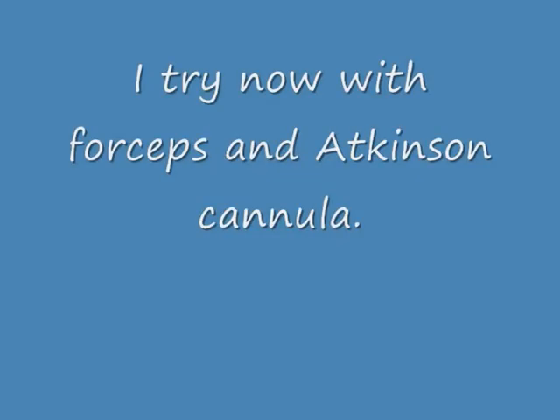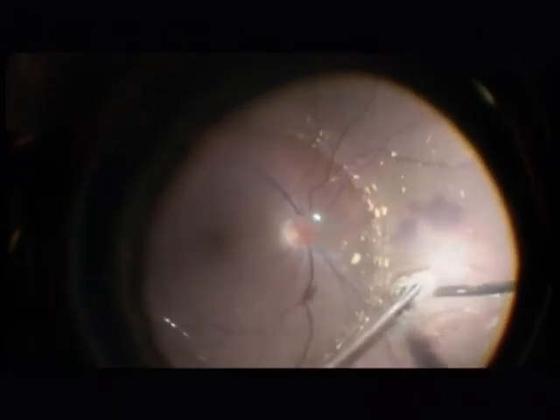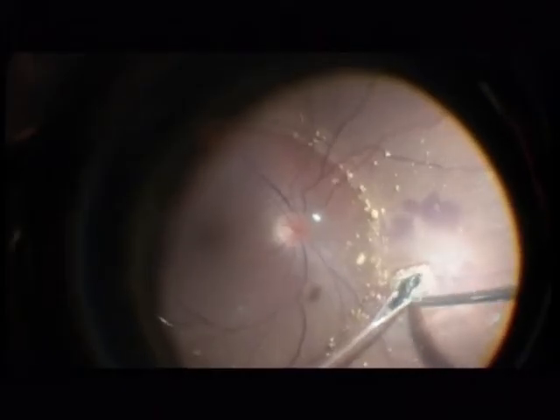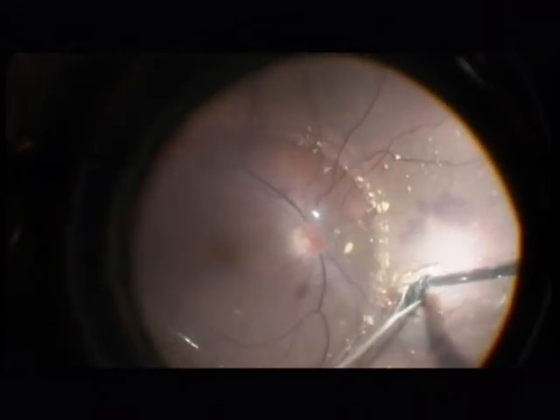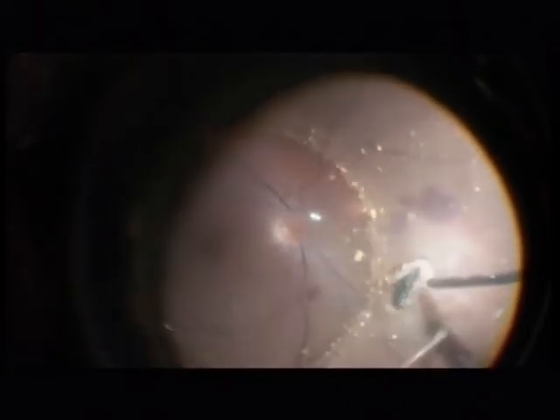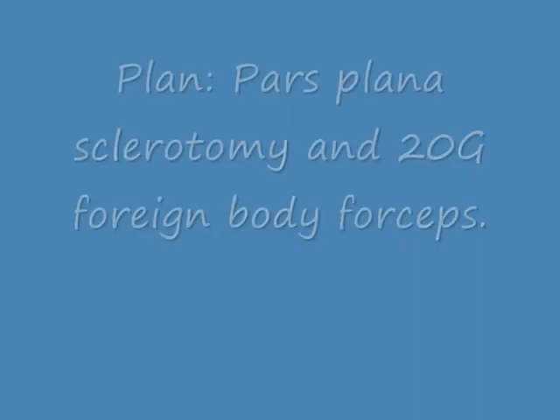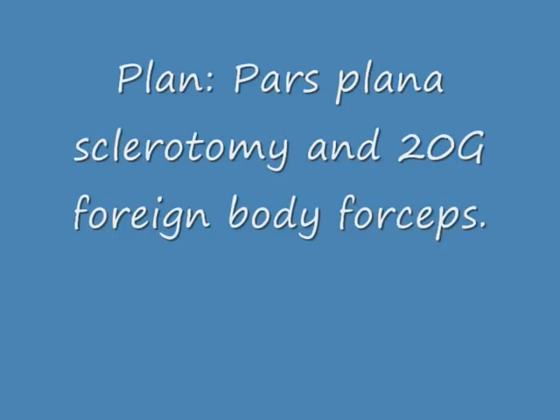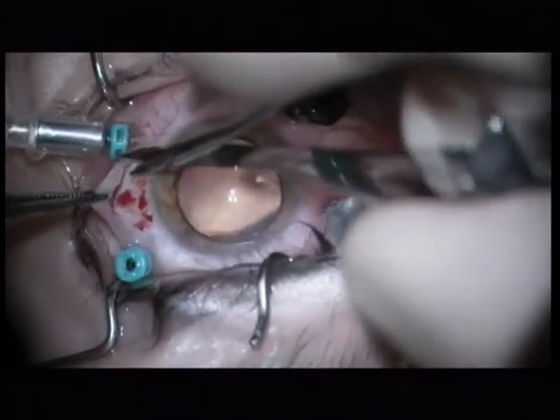Even with two forceps I do not succeed removing the foreign body. So I try again with forceps and Atkinson cannula, to get it out from the side — but I can tell you now I will not succeed. I am only inducing a focal retinal detachment.